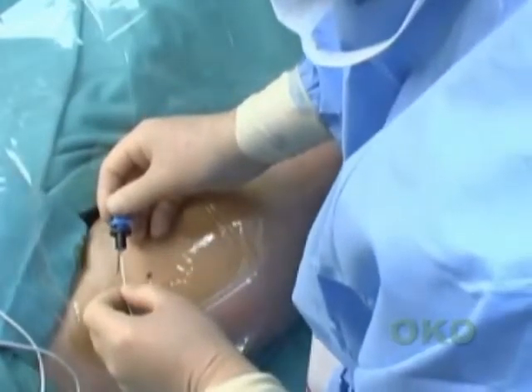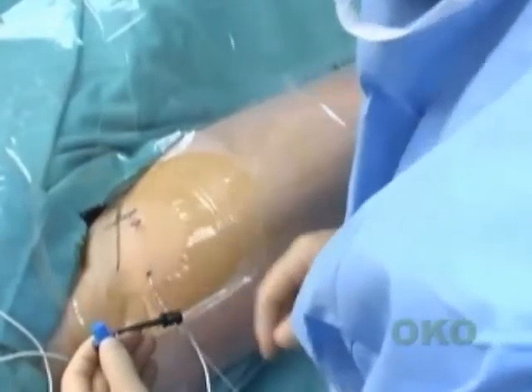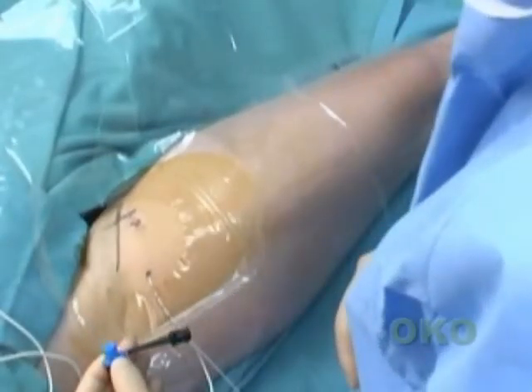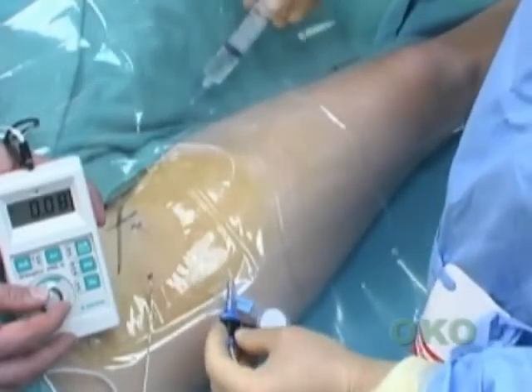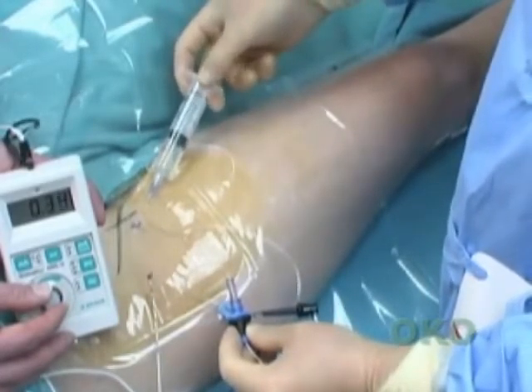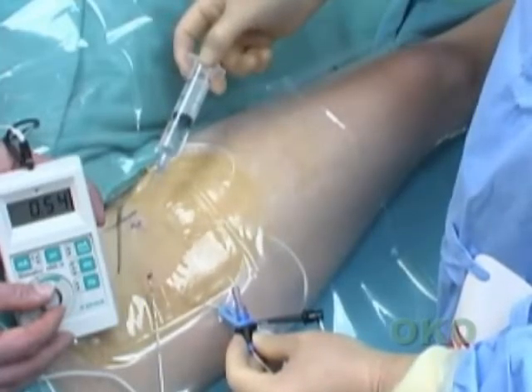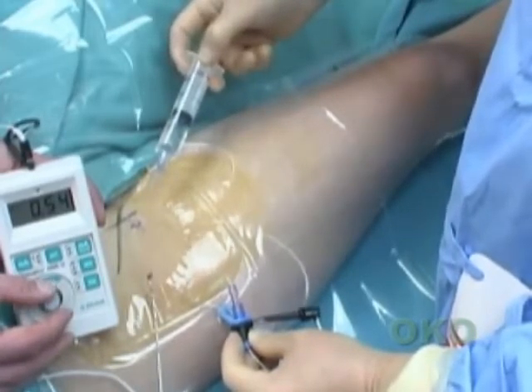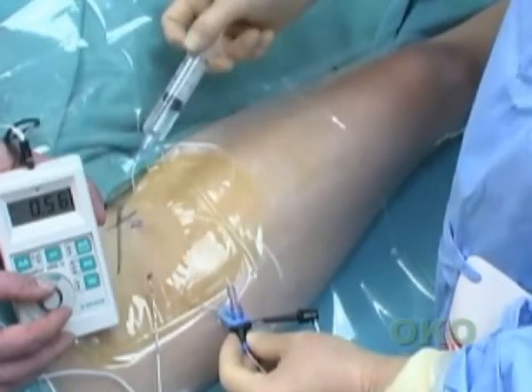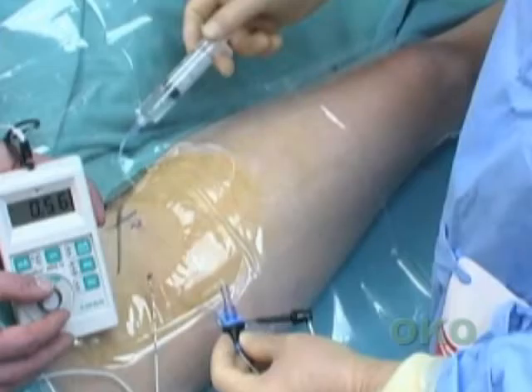The snap lock is attached to the proximal end of the catheter. The nerve stimulator is clipped to the snap lock, and the nerve stimulation is set to an output of 0 milliamps. The nerve stimulator output is turned up slowly until a quadriceps muscle twitch can just be seen. Local anesthetic agent, or as in this demonstration, normal saline, is injected and the motor response immediately stops. This constitutes a positive Raj test, which is a further indication that the secondary block will be successful.